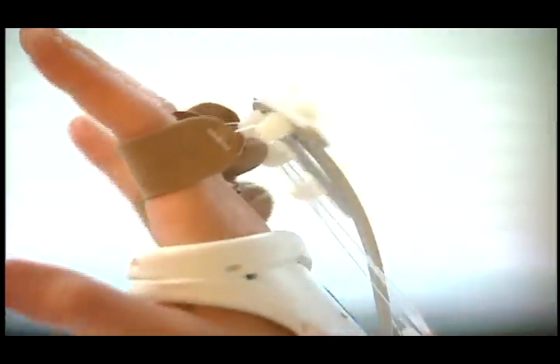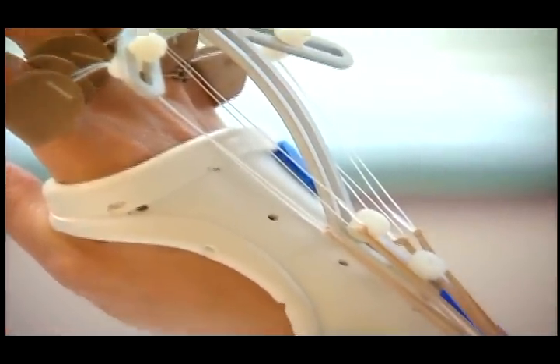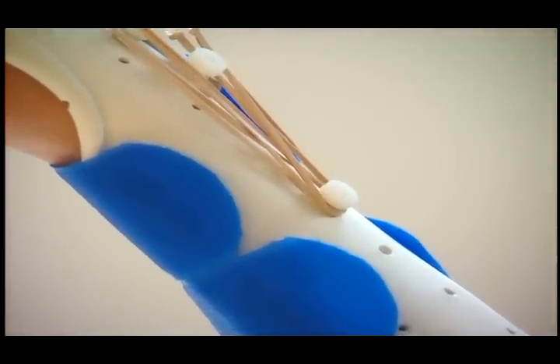There are also several types of commercially available outrigger kits. These are usually applied by drilling or punching holes in the splint base and attaching the outrigger with specially designed thumb screws. After the splint is finished, it is important to evaluate it for proper fit and patient comfort.